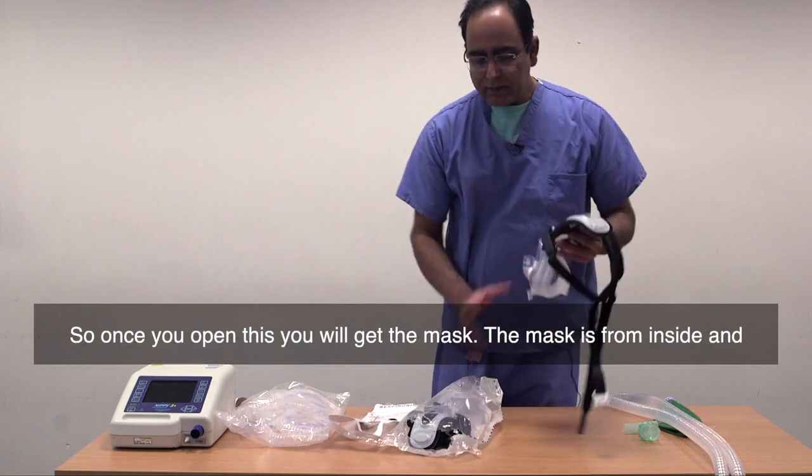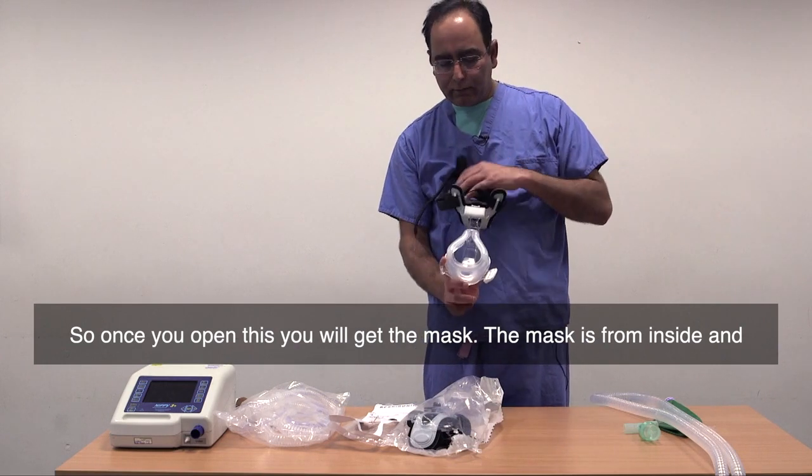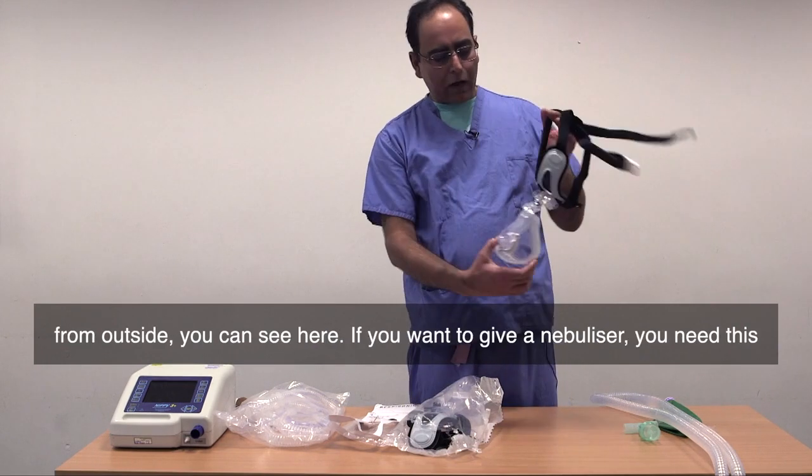So once you open this, you will get the mask. The mask has an inside and an outside.